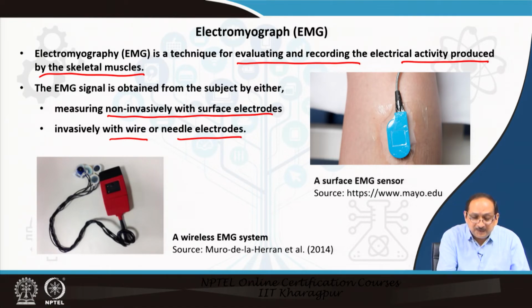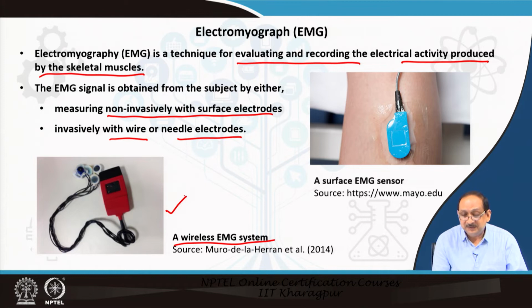So, a typical wireless EMG system is shown here on the left, and a surface EMG sensor is given on the right.